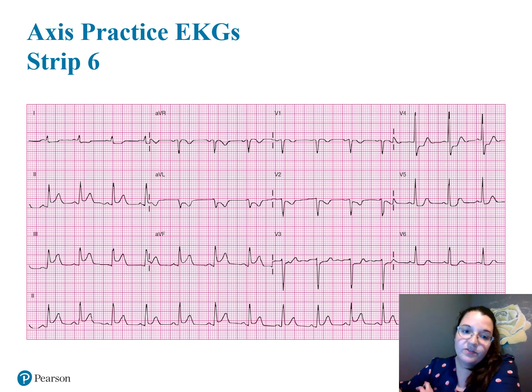Now you have your full 12 lead. So remember, we have lead 1, 2, and 3, AVR, AVL, AVF, V1, V2, V3, V4, V5, and V6. And that bottom line is going to be lead 2. The very first step of my 6 steps to interpret a 12 lead rhythm is to figure out the basics. Step number 1, which is interpret it. So you would use this bottom lead to interpret that single rhythm.